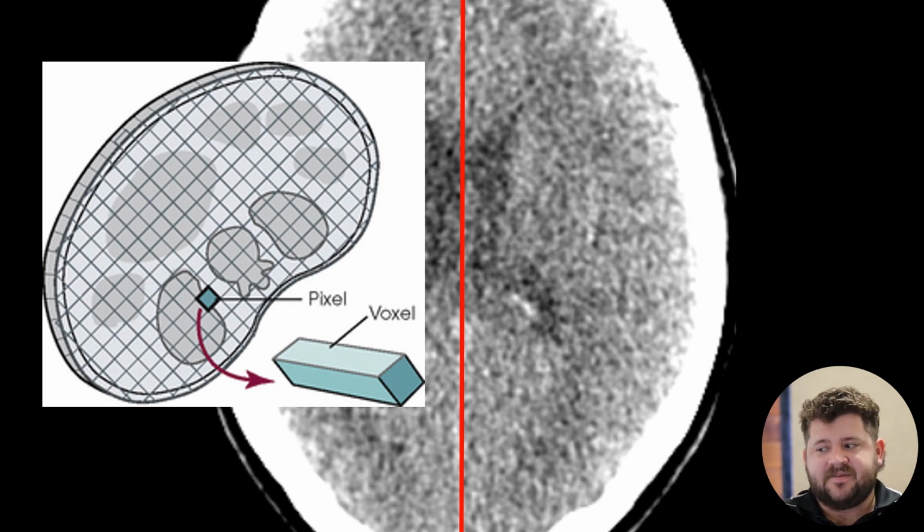So we've got to remember though that our system isn't looking at two tanks, comparing one side to the other. It's measuring thousands of individual voxels within the brain. So if we go back to remembering our CT basics, what a voxel is, it's essentially the pixel by the detector width, and that is each individual tissue or brain tissue that it's sampling and comparing against each other. So again, this is why any little bit of movement in our scan can really impact our CT perfusion results.